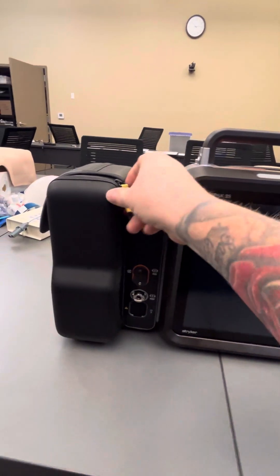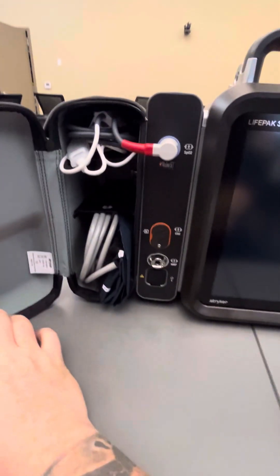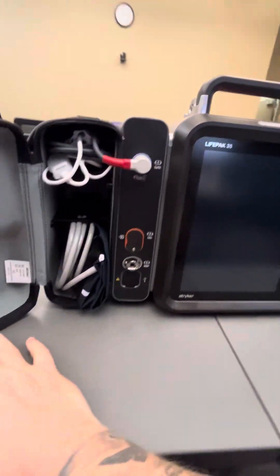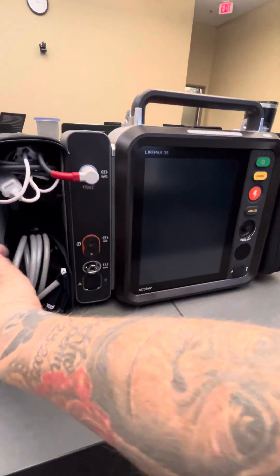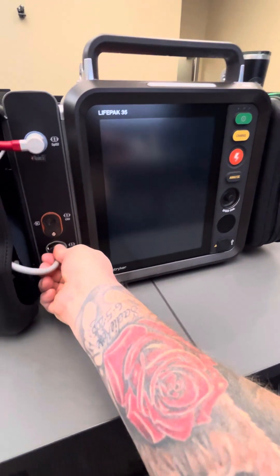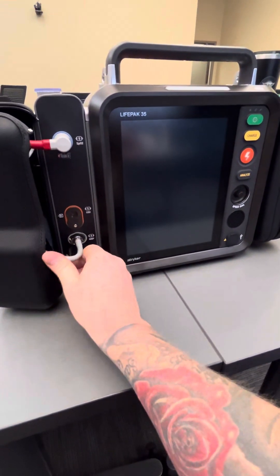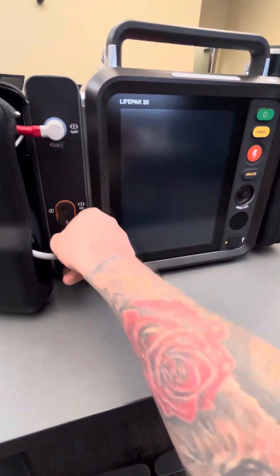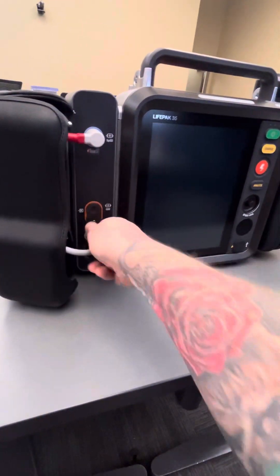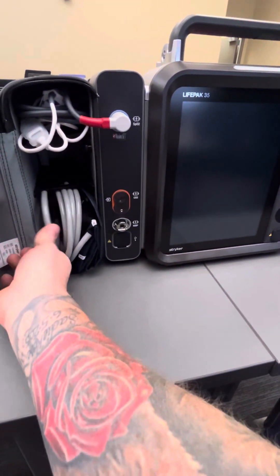Moving over to the left, this is where your pulse ox and blood pressure cuffs are kept. You'll notice the blood pressure cuff is not plugged in — as long as you do not have it connected to a patient, it should not be plugged in. Leaving it plugged in is not acceptable, as it will cause the rubber hose to bend and break down over time.